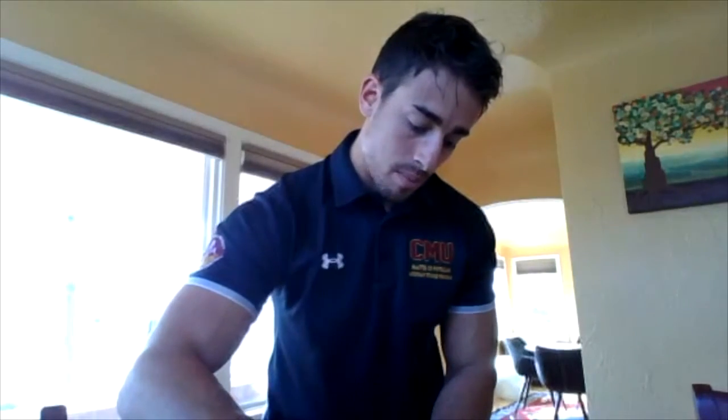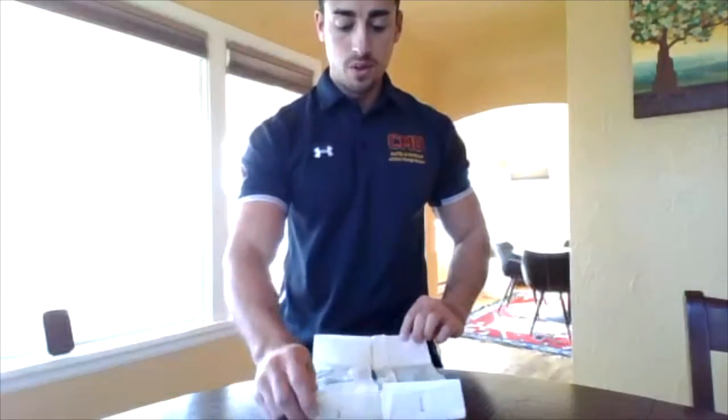So to begin this procedure, we're going to begin by washing our hands, and then we're going to measure out the length of the lesion, or the diameter of the lesion. So it's 5 millimeters by 5 millimeters. So this indicates that we should be using the 5 millimeter punch biopsy device. All right, so at this point, we will place on our sterile gloves, which is something that we all know how to do at this point.